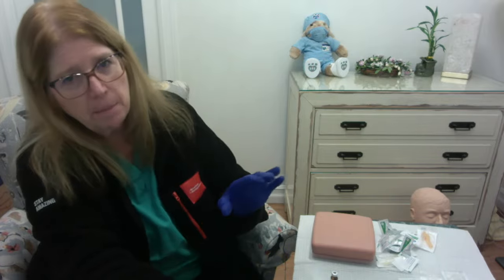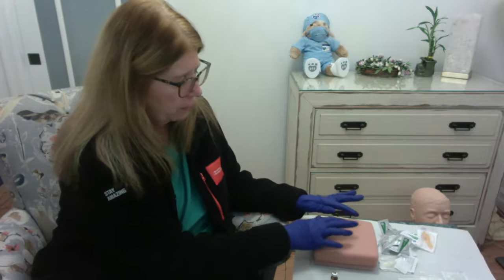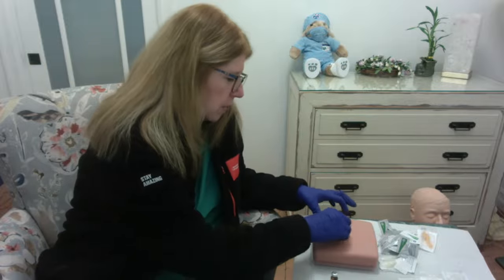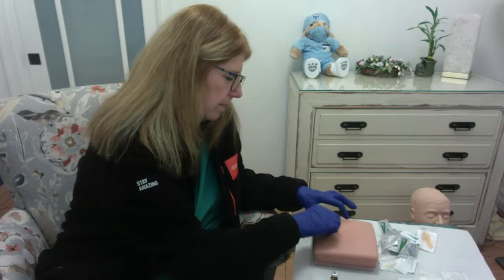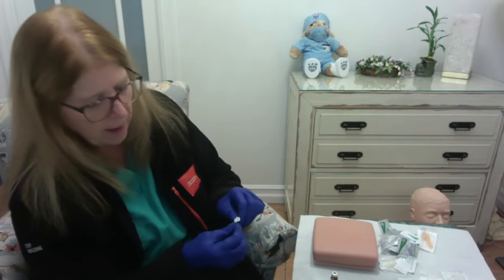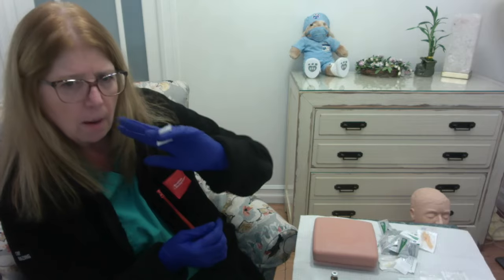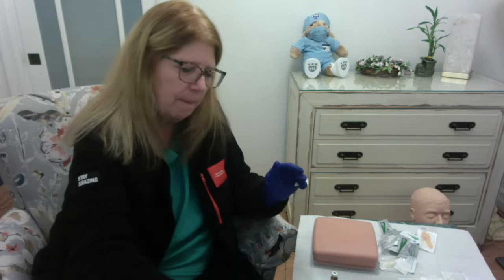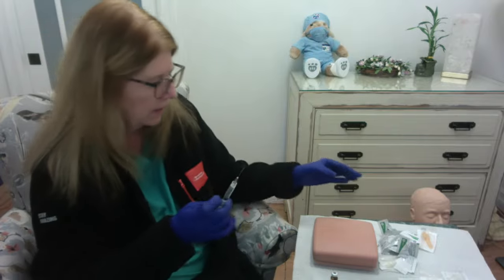So I'm going to find my landmarks for my ventrogluteal area. And once I have determined that this is my spot, I'm going to cleanse my area with the alcohol, okay? Starting in the center, round, round, round, round, out, right? Okay. I'm going to let that air dry. I'm not getting rid of my alcohol. I'm actually going to keep my alcohol between my pinky and my ring finger on my non-dominant hand, okay? I'm going to remove my cap straight up, no twisting to get the caps off.